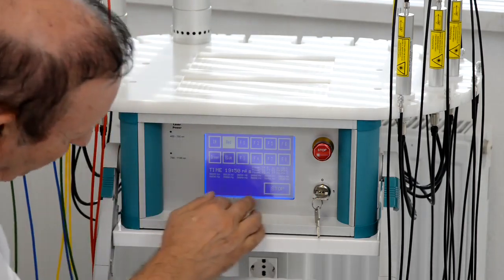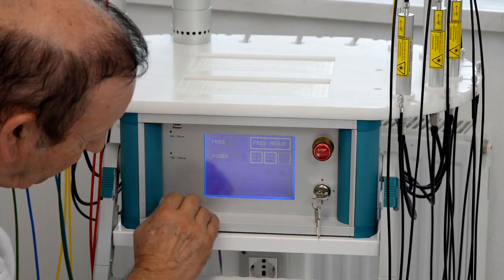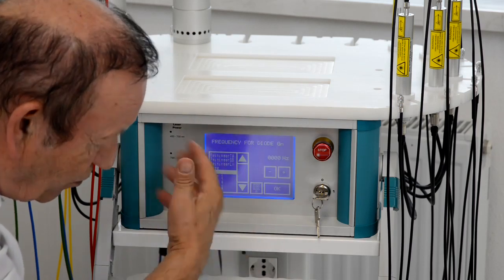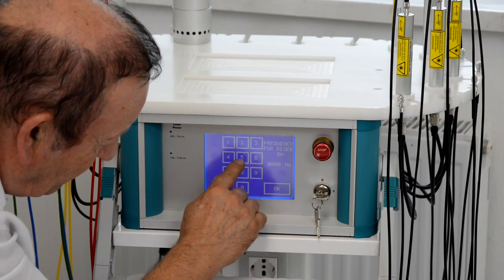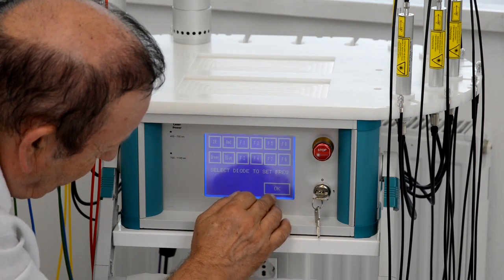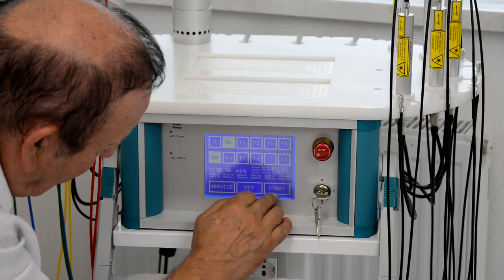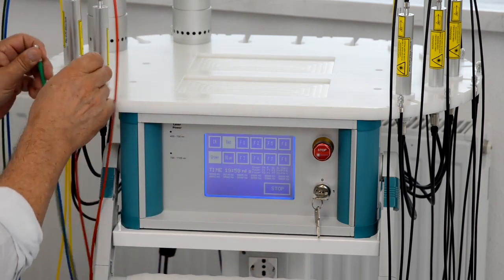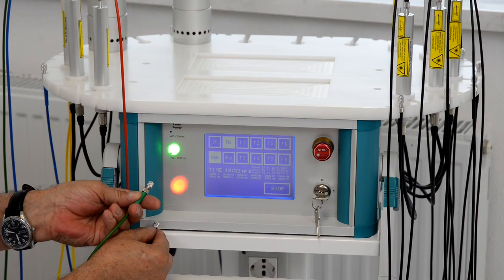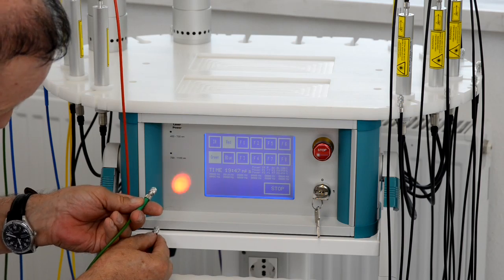If I want to make it even more complicated, I can set a different frequency on the green laser. So I go in set mode again, frequency mode. I check the green laser. And then I want to put in a very low frequency, maybe 5 Hertz only. I press OK. No other frequency. Confirm everything. Press green and press start. And now you can see that the red and green are working on different frequencies. So I can put up to 12 different frequencies on each laser.